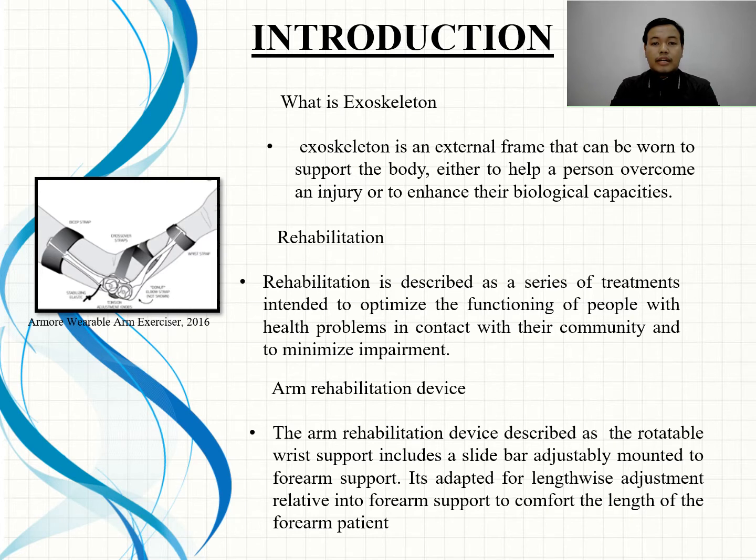What I'm focusing on right now is arm rehabilitation. The arm rehabilitation device is one of the rotatable wrist supports, including a slide bar adjustably mounted to the forearm support. It is adapted for lengthwise adjustment relative to the forearm support to suit the length of the patient's forearm.